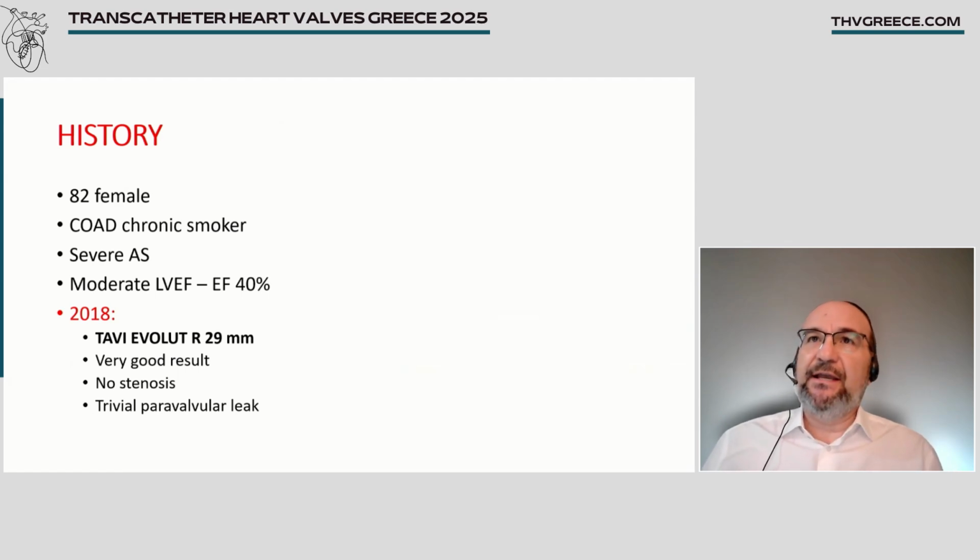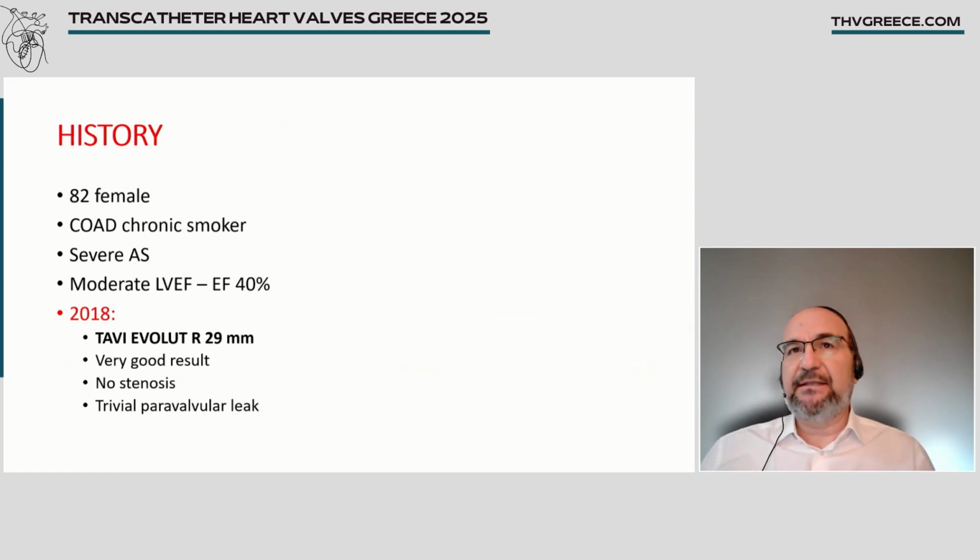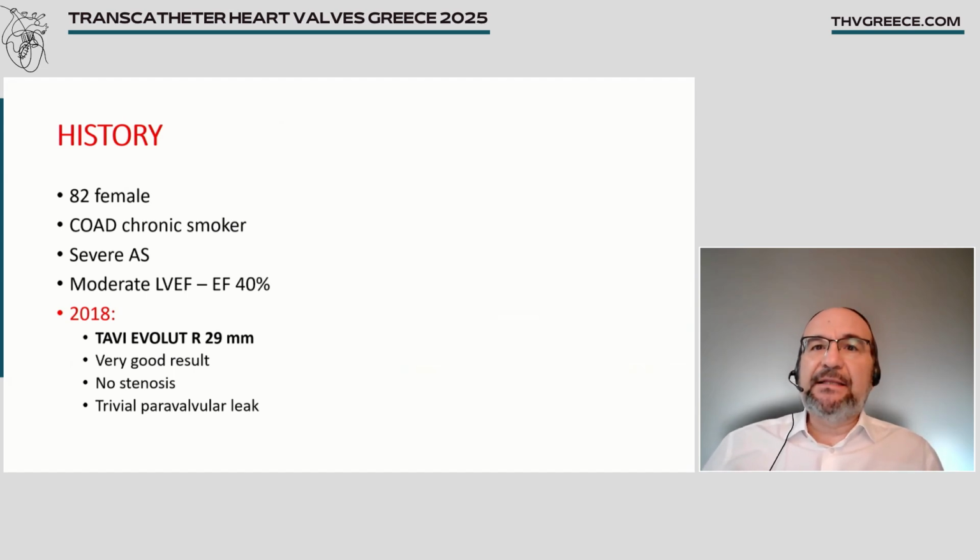The difficulty with this subject, TAVI in TAVI, is that it's a new subject, and it comes more and more every day. But there are a lot of things that we need to know about it, and it's brand new terminology actually. And in the next about 20 minutes, I'm going to go through a case and show you what we need to know when we prepare a TAVI in TAVI case, and what is the crucial role of the CT. So let's start with the case.